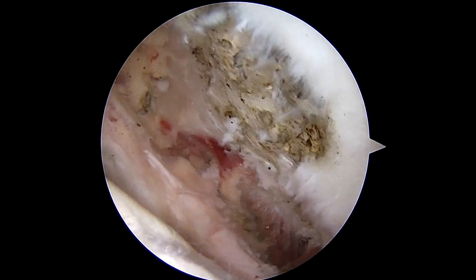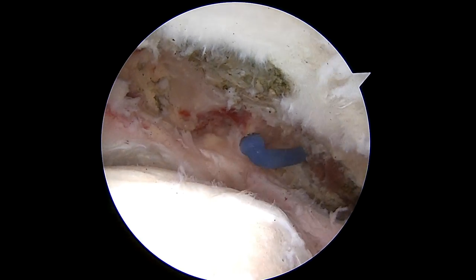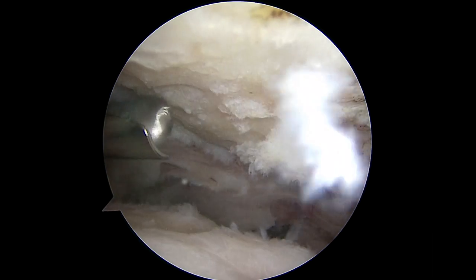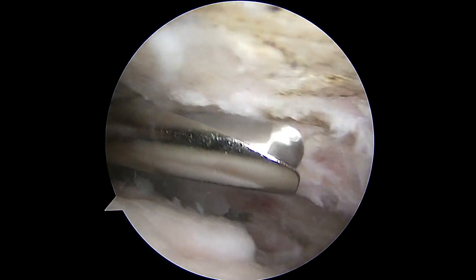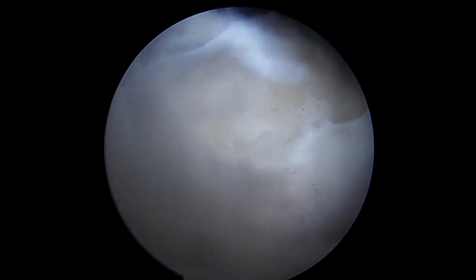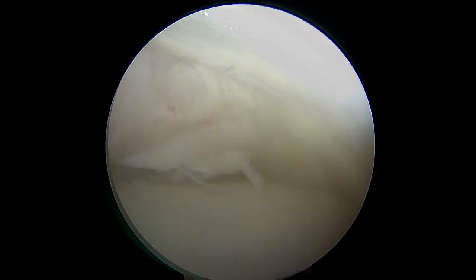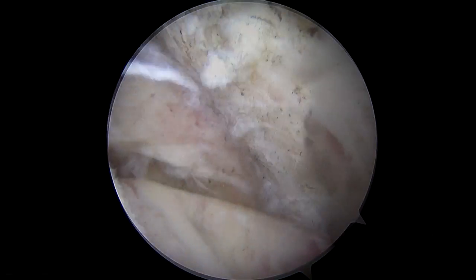We have what looks like some infraspinatus here — you can see some intact cuff coming across. Next I'm going to get all the soft tissues off from the undersurface of the acromion; that's going to help me visualize things better and help me do any acromioplasty that I might need to do. We'll just do a subacromial smoothing here, running it on reverse again to keep it from skipping. There's really no mobility to this posterior leaf — nothing meaningful there at all. He has nothing repairable over that big span.